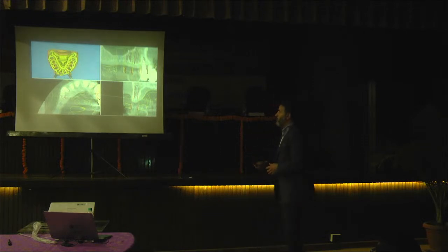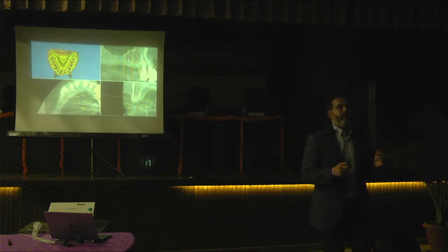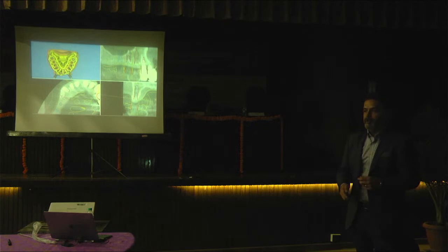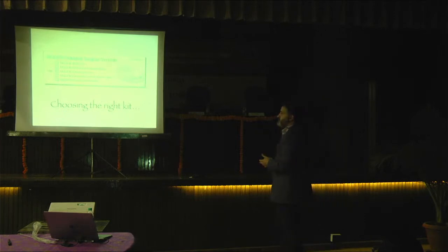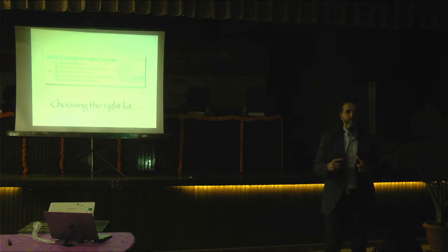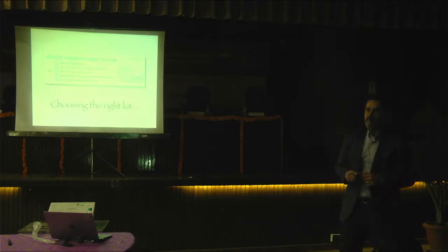So we try to help you understand where you are, where you finish. And this is the thing stuck on the guide box, and with the help of this guide box, you can understand which kit to use.